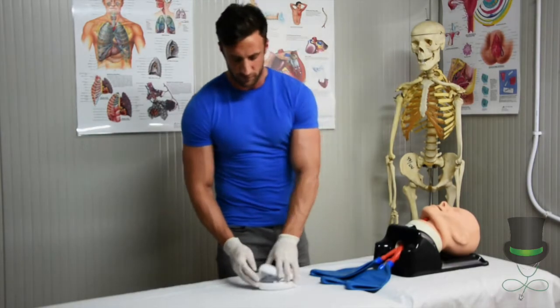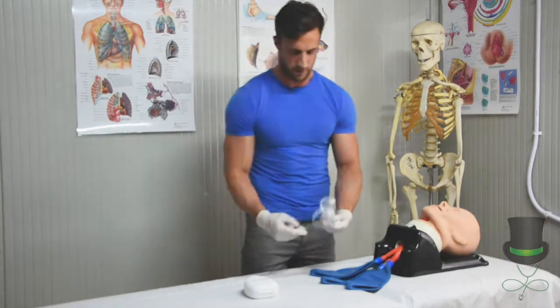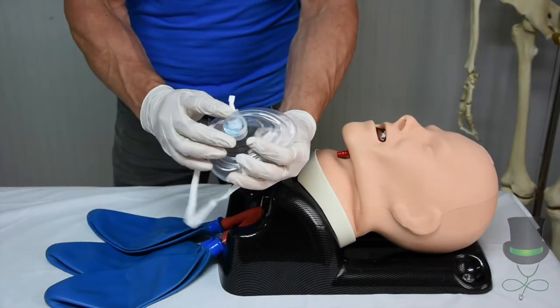First off, remove the pocket face mask from this box. Apply pressure on the inner part of the mask to release the mouthpiece and valve.